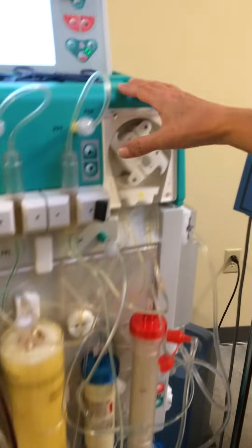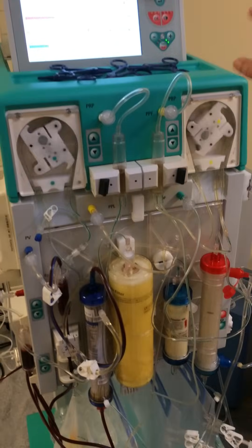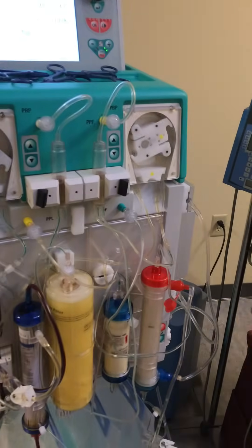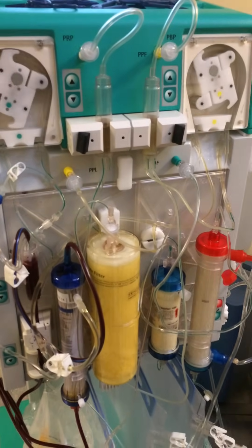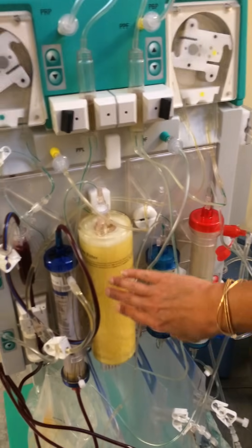This is the B. Braun Futura machine. It's an apheresis — particularly a selective LDL apheresis machine — but we know the filter will precipitate many other factors, particularly inflammatory factors and some cytotoxins, among other things that will be removed with the filter.